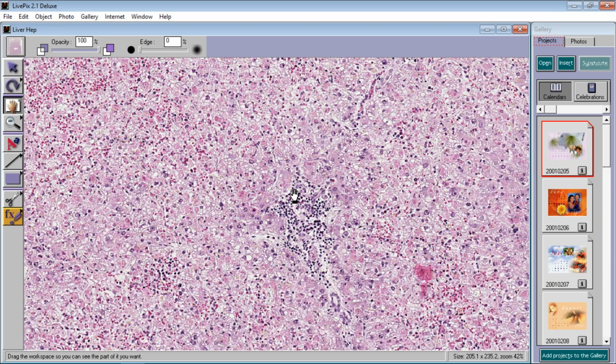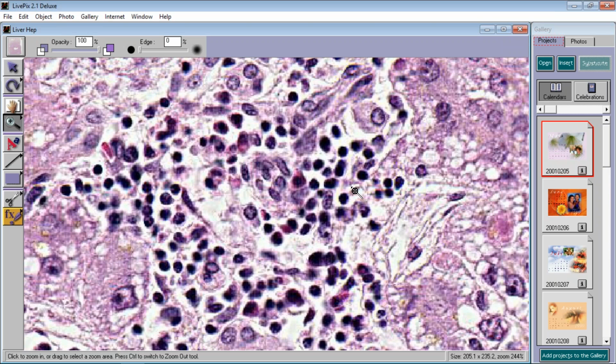Now, do you want to call it acute hepatitis again? This is another trick question. Do you want to call this acute hepatitis, or do you want to call it chronic hepatitis? Well, I think you'll agree most of these cells are lymphocytes, so you might be tempted to call it chronic. But remember, this is if it's caused by a virus, okay, this could be an acute viral hepatitis clinically, and like many other viral infections, even though it's acute clinically, it might be characterized by the types of cells that battle viruses, which are lymphocytes rather than neutrophils.